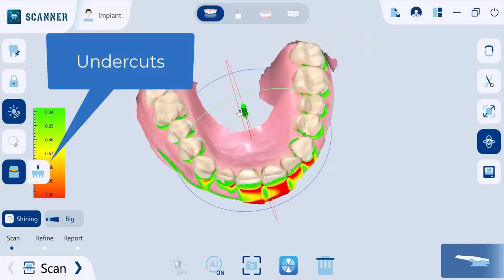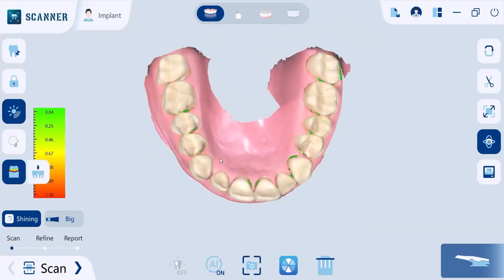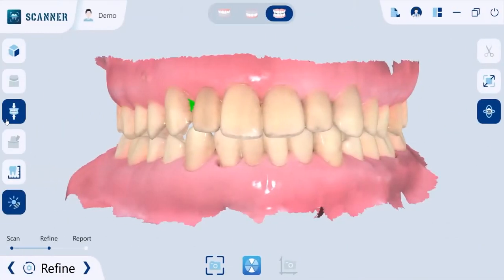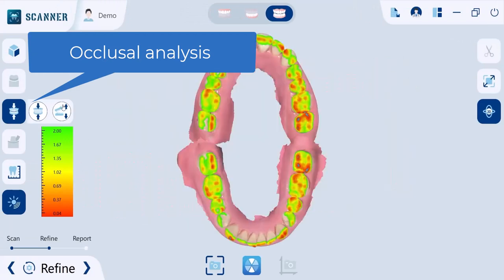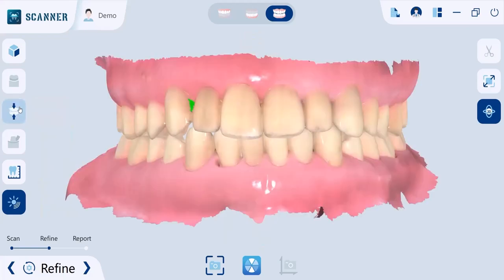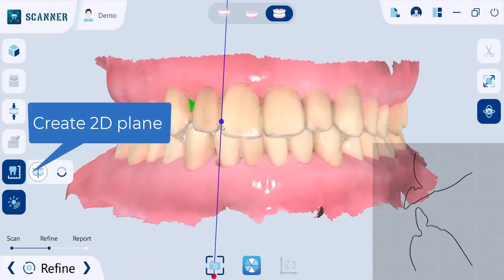Check the undercut areas on the preparation site with the undercut check tool — it works in the direction where you place the model. You can also have an occlusal analysis that analyzes the interference between the maxilla and the mandible and displays the result through a color map. If you acquire occlusal contacts using articulating paper, you can compare the digitized occlusion analysis and the articulating paper to take measurements, generate cross-sections to check the 2D outline of the models, and take accurate measurements.